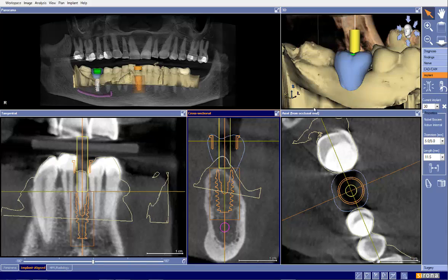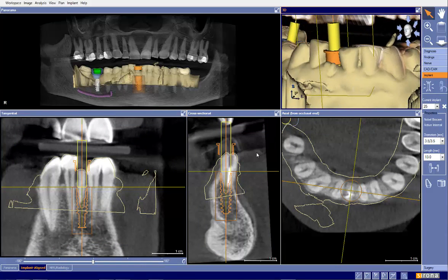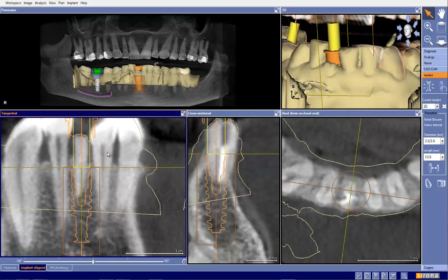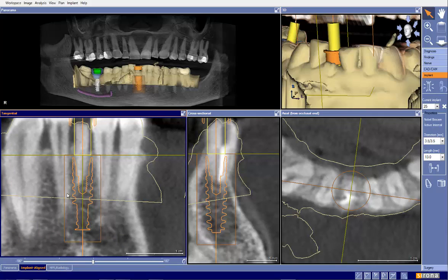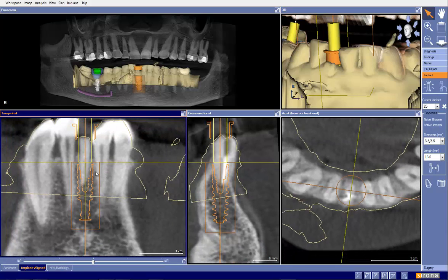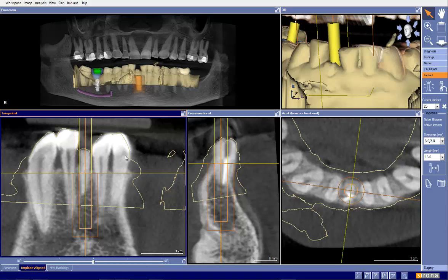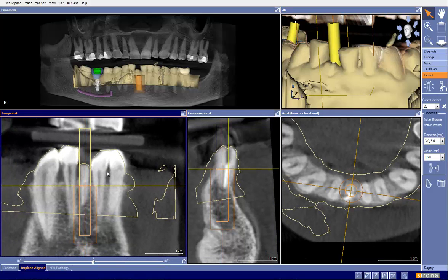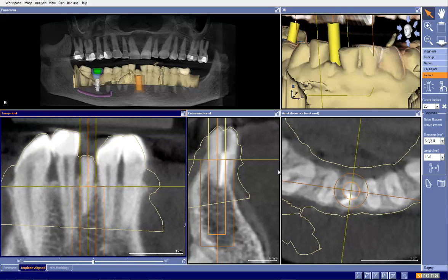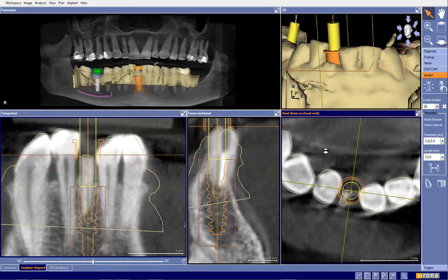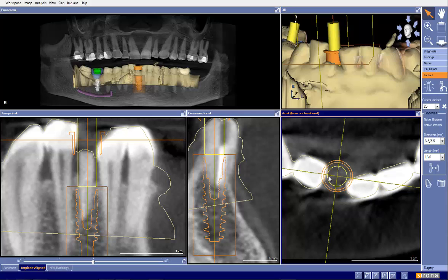Let's take a look at tooth number 25. Lower incisors are a different ballgame — they're tight. My initial assessment is we are very close to the adjacent teeth. When we get close to adjacent teeth, we risk devitalizing them and losing bone, so we have to be careful. But patients want a solution, so I would encourage you to look at going with a 3.0 millimeter implant here. The issue with the 3.0 and 3.5 millimeter is that doing this guided, we can see we're hitting the adjacent teeth — we have no way of seating this guide, and it's also impinging on the tissue.